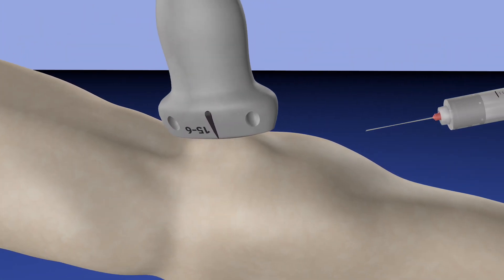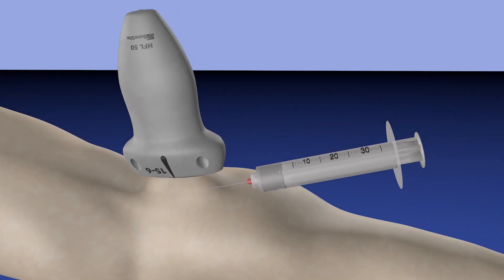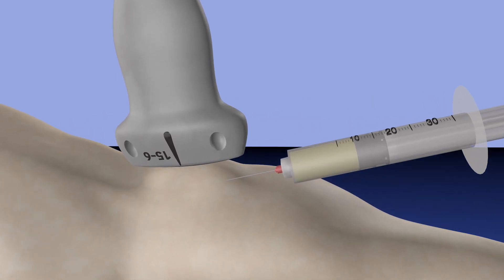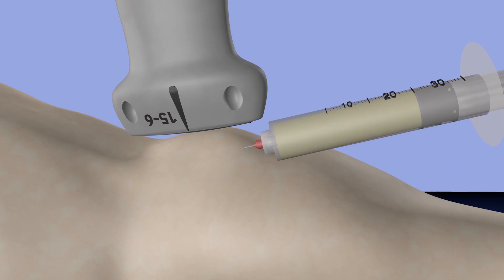This is our approach for the injection. Our probe is essentially in a sagittal orientation with our needle going right under it, so this way we are in long axis to the needle. And here we are aspirating some fluid out of the Baker's cyst. If there is a septum, you may have to further advance the needle, which you can see here as well, in order to get all the fluid.